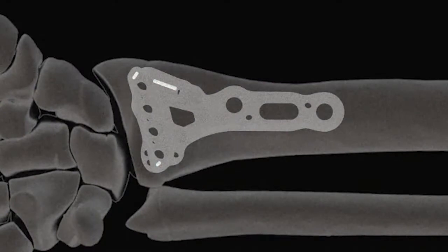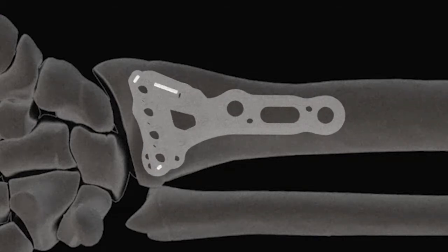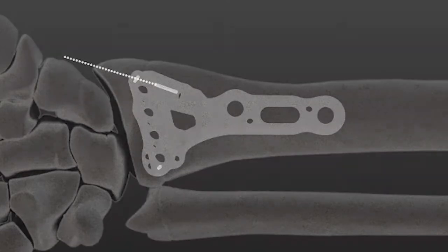To verify plate placement, a radiopaque styloid post is utilized in an AP view to project the trajectory of the most distal styloid screw. To align styloid screw placement, position the wrist under fluoroscopy in an AP view and adjust the plate so that the positioning post targets the styloid tip. This verifies correct trajectory of the styloid screw prior to drilling.